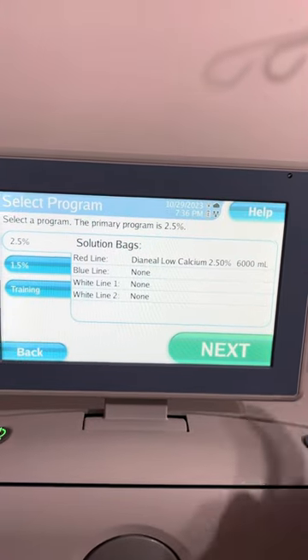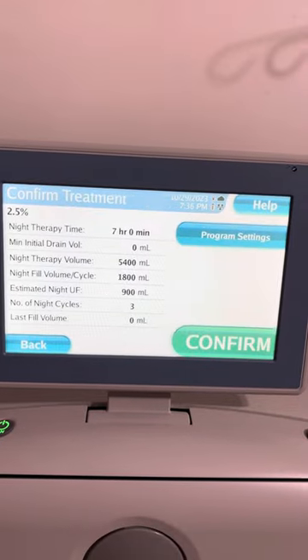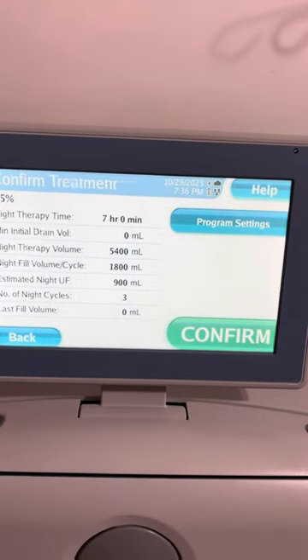Select a program, then touch next. Review your program settings, and if necessary, touch program settings to modify.